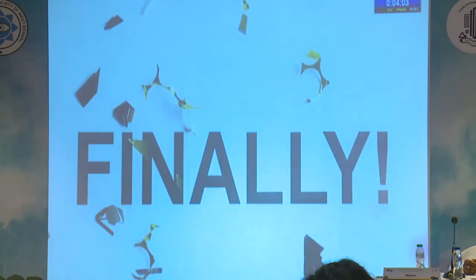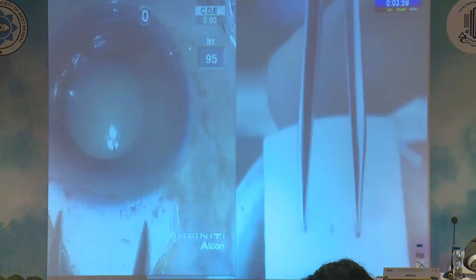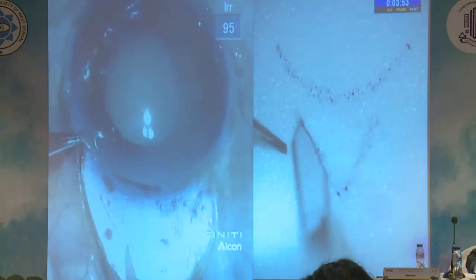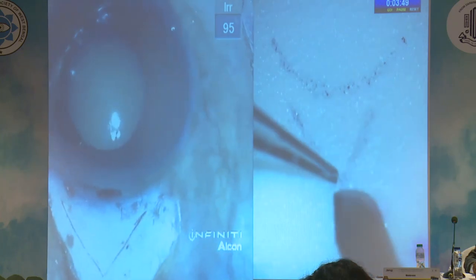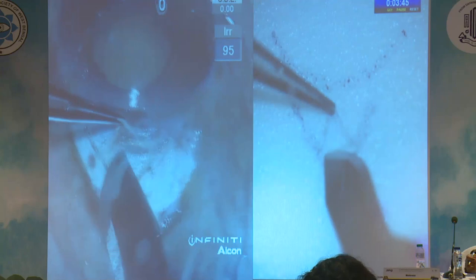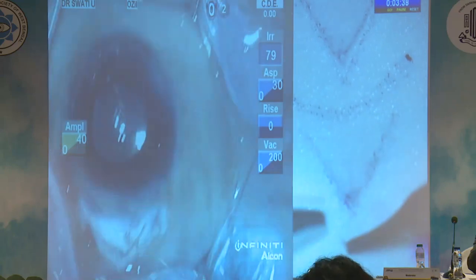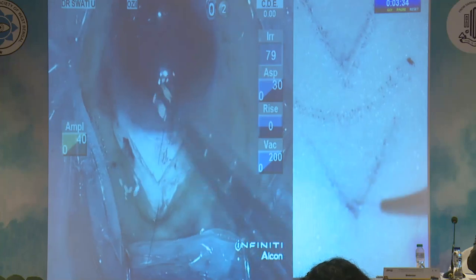We finally tried working on the plan for which all started, to learn to raise the flap. So, we took the waste sponge, marked the specifications of the flap with calipers, and raised the flap with its blade. And sutured the flap. The sponge gave the feeling of the sclera indeed.